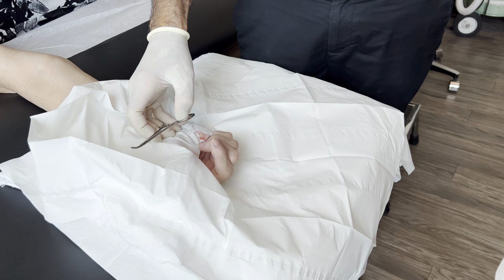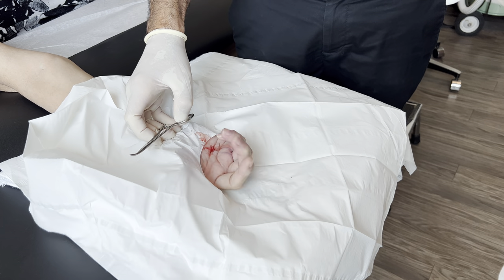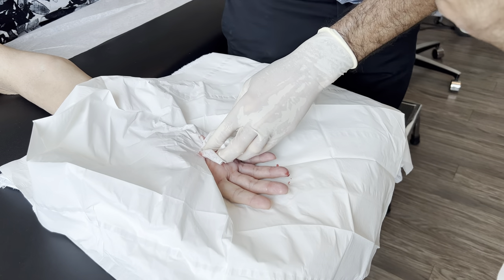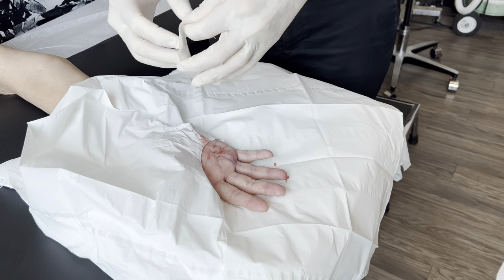Want to make a fist now? Squeeze hard. Straighten out. Squeeze hard. Straighten out. You feel the difference? Yeah. You're all done. I feel a little thing but not anything like it was.